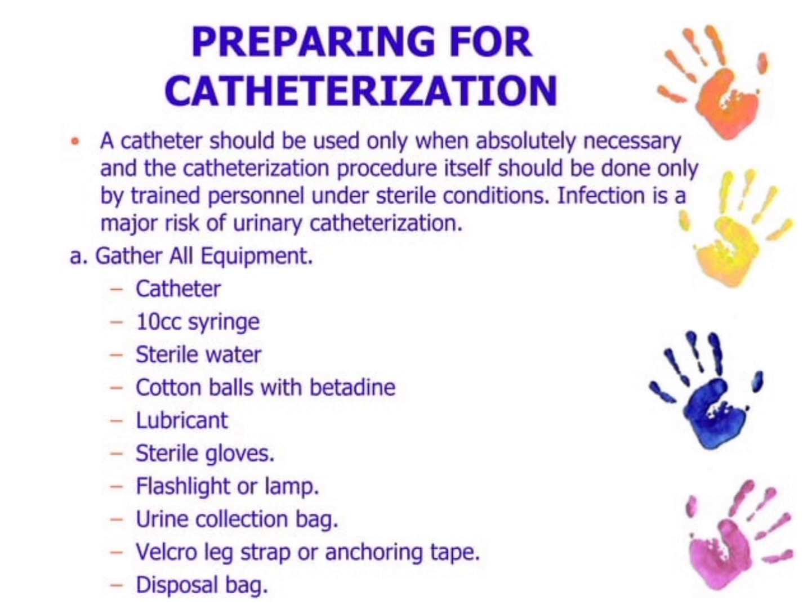Preparation for catheterization. A catheter should be used only when absolutely necessary, and the catheterization procedure itself should be done only by a trained person under sterile conditions. Infection is a major risk of urinary catheterization.